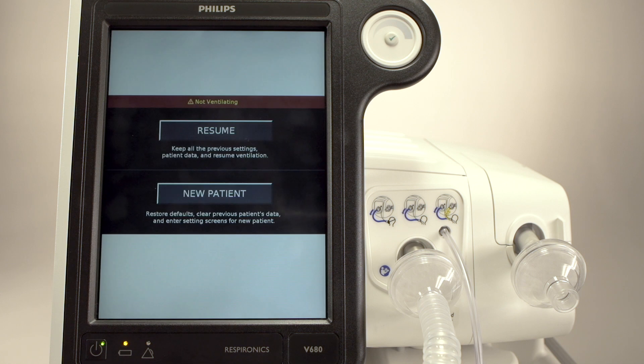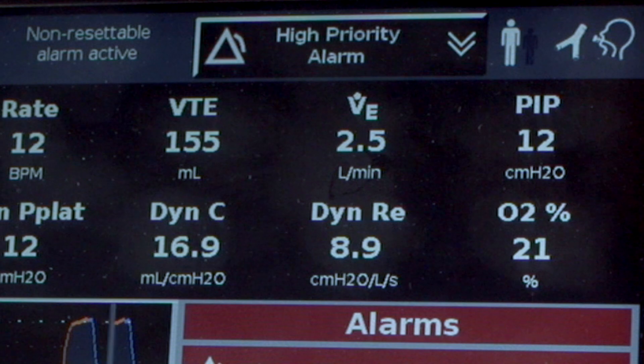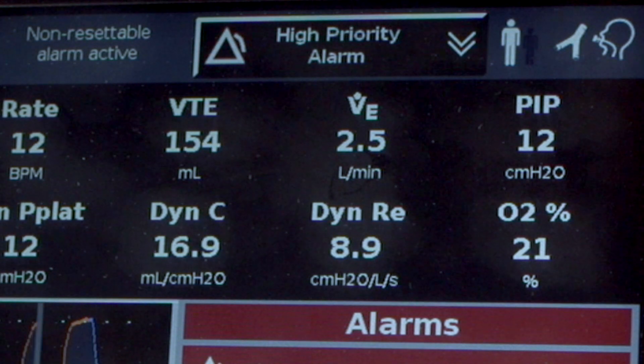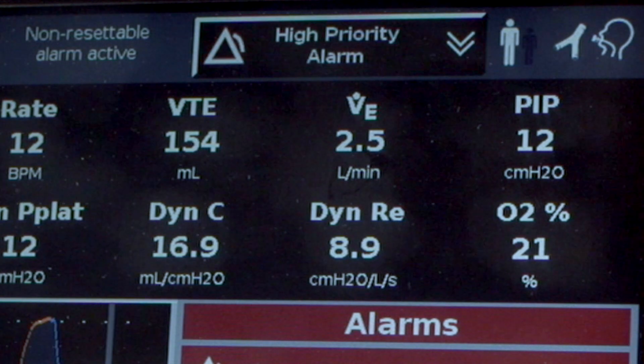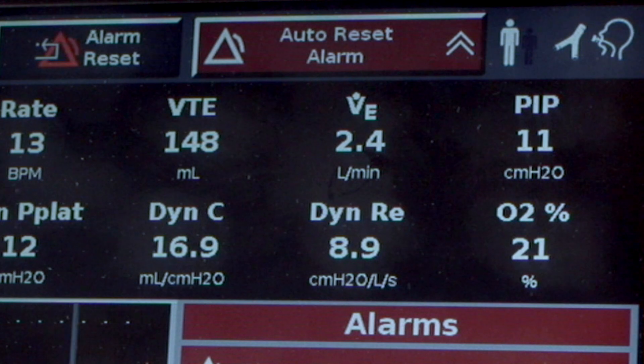This is a good time to mention that V680 has an escalating audible alarm feature that will get progressively louder if a clinician does not respond promptly to a high-priority alarm. The audible alarm will escalate to the maximum decibel level, regardless of where the alarm volume was set. This is a unique safety feature.